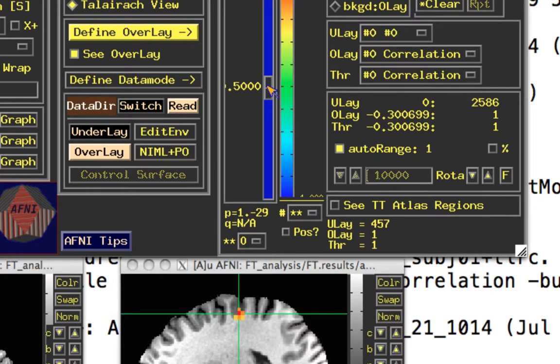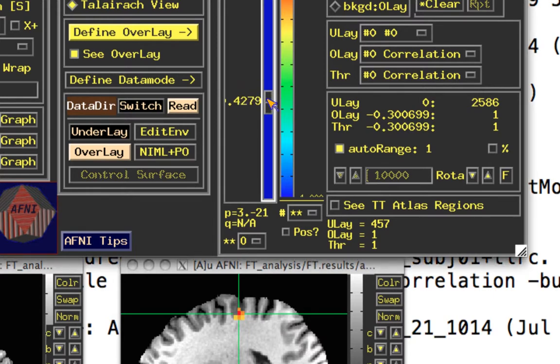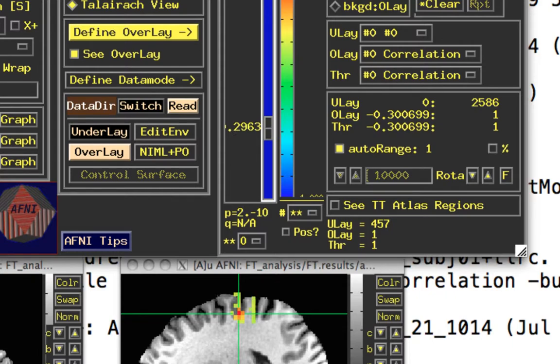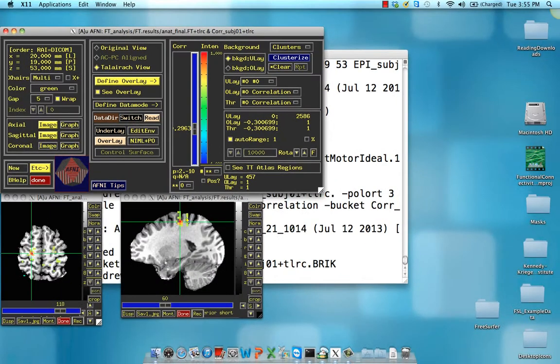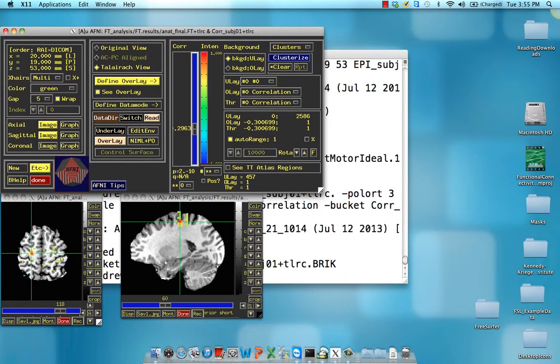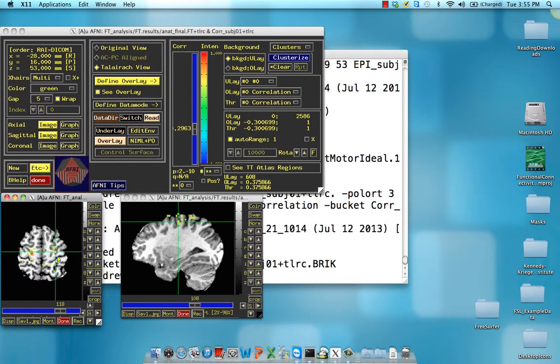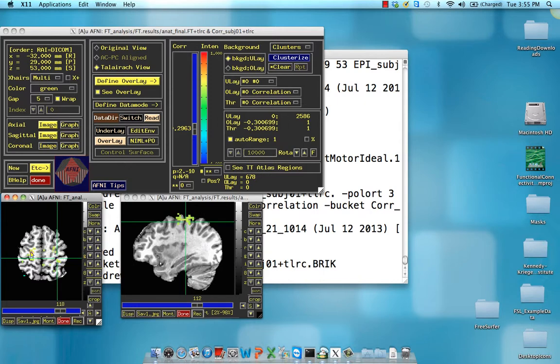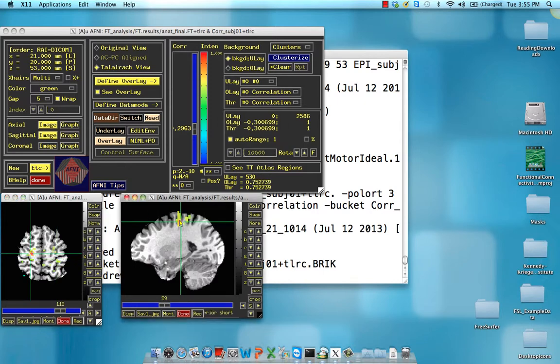So right now it's at 0.5 and we're going to lower it a little bit. And as we do to about 0.3 or so, you see that there does appear to be some correlation, little scattered stuff on the right side of the brain. A lot of stuff in the immediate vicinity of the seed region that we chose, which is also not surprising, given that a voxel will have a similar time course to a degree as its neighbors.